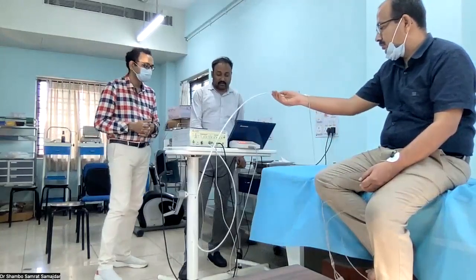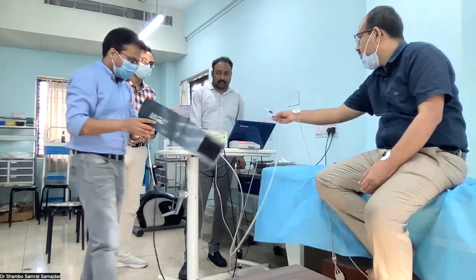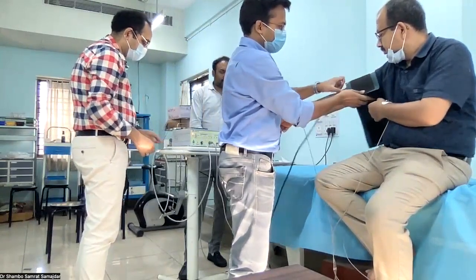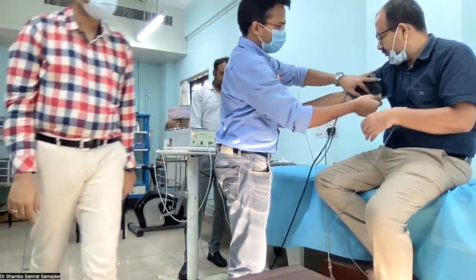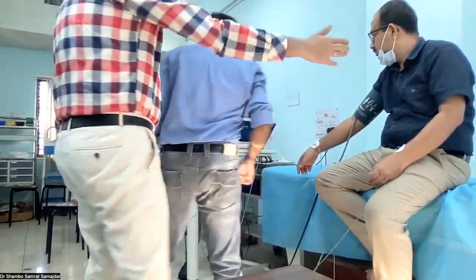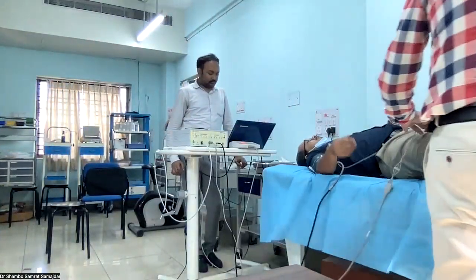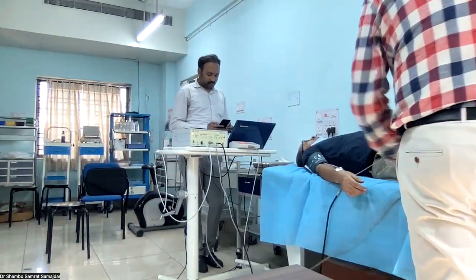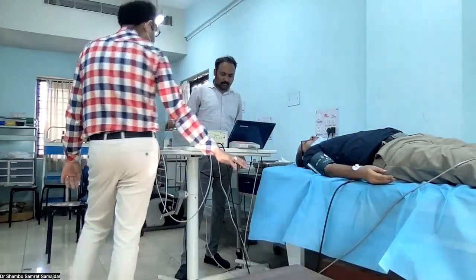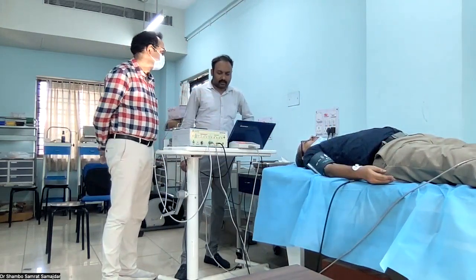So we'll start with the orthostatic hypotension part. First of all, you need to lie down. So we will start the test after a few seconds, after the patient becomes a little bit stable.